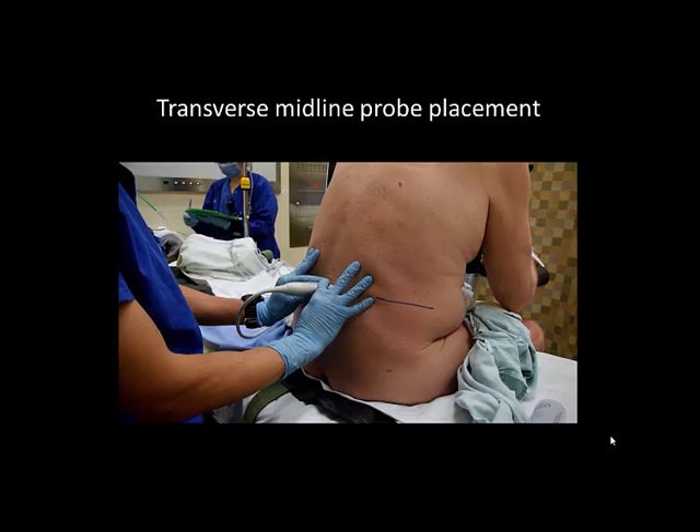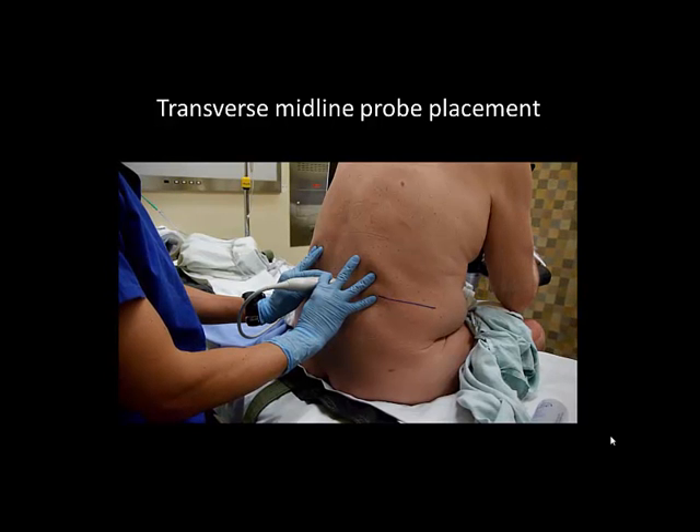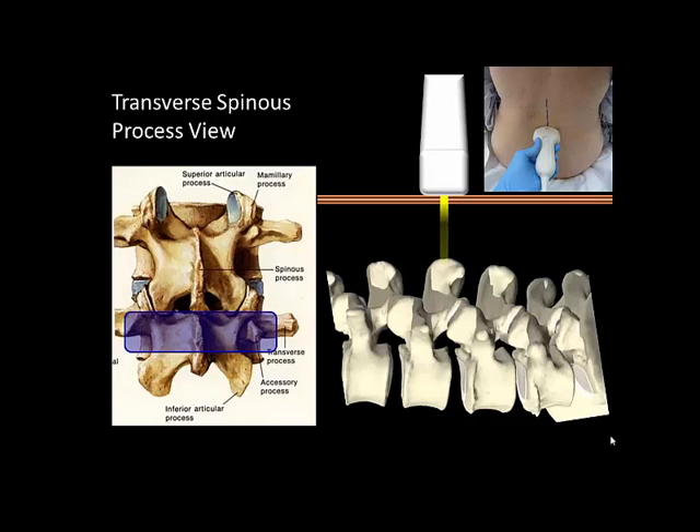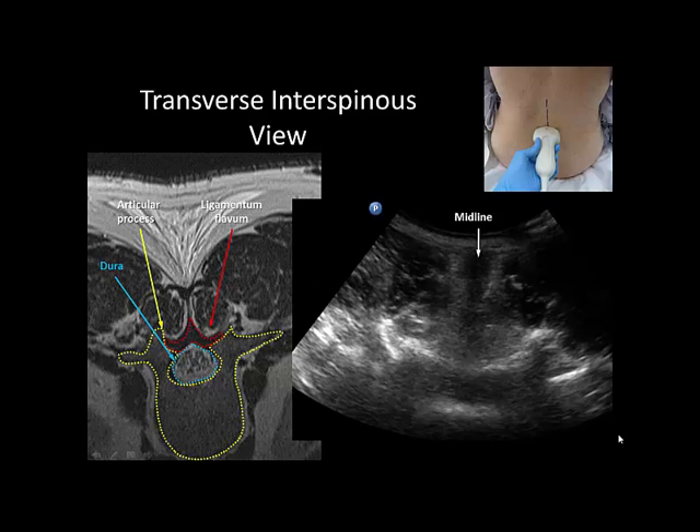A two-handed grip with fingers braced on the patient's back offers the most control and stability of the probe. There are two possible views that may be obtained. The first is the spinous process view, in which the probe and beam are directly over a spinous process. The second is the interspinous view, in which the beam is directed between adjacent spinous processes. The interspinous view is essential for the ultrasound-assisted midline approach as it identifies the soft tissue window through the interspinous and interlaminous space.